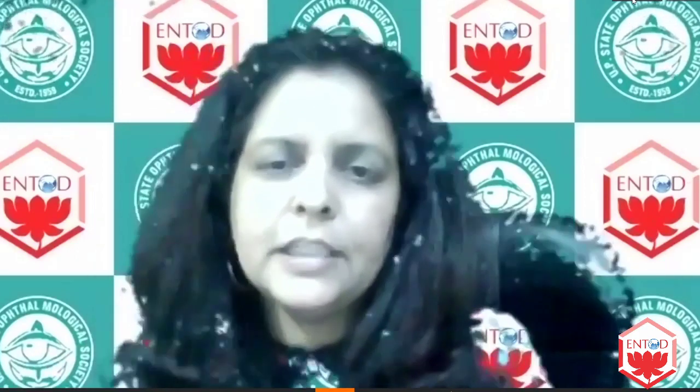What we understood was that it should be done before the rexis, but if it is done after the rexis, we should inject visco below the iris, and simultaneously we can move the ring to the right and left so that we are sure that it has not caught the capsulorhexis. That's it, correct, sir? Okay.